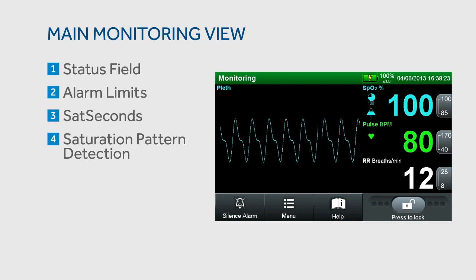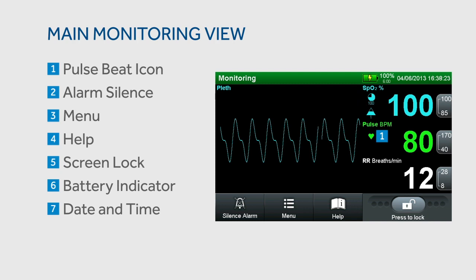The main monitor view includes a status field, upper and lower alarm limits for SpO2, advanced alarm management tools of SAT seconds and saturation pattern detection, pulse beat icon, alarm silence, menu, help, screen lock, battery indicator, and date and time.